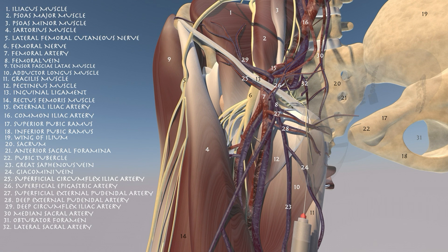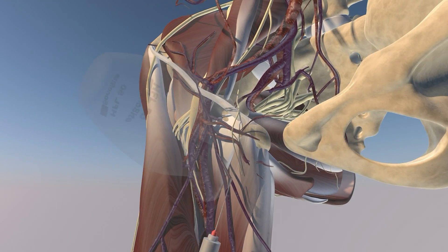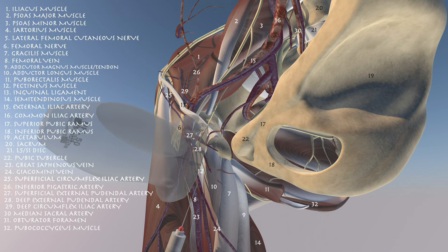Here's some of the musculoskeletal anatomy and neurovascular anatomy in the groin, and this injection is going to be medial to the main neurovascular structure. You can see here the probe is almost invisible, and here we're making it a little bit more visible — this is essentially the approach of this procedure. We're in a sagittal oblique plane.